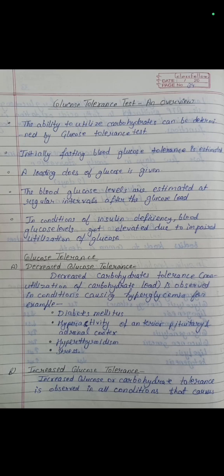So glucose tolerance, the ability to utilize carbohydrates, can be determined by this test, the glucose tolerance test. Initially, fasting blood glucose is estimated. Then a loading dose of glucose is given. Then the blood glucose levels are estimated at regular intervals after the glucose load. And in the condition of insulin deficiency, blood glucose levels get elevated due to impaired utilization of glucose.